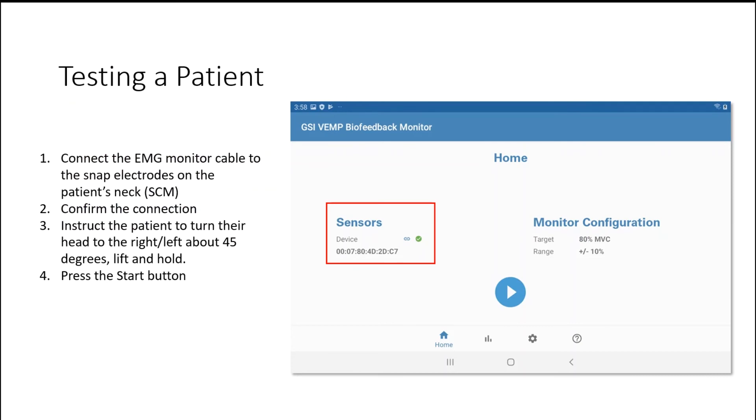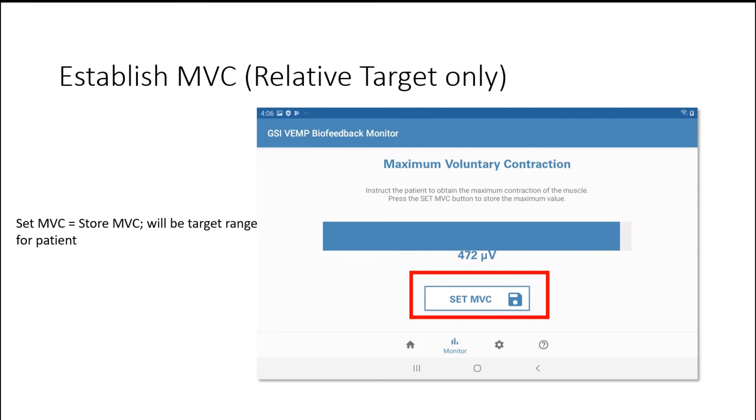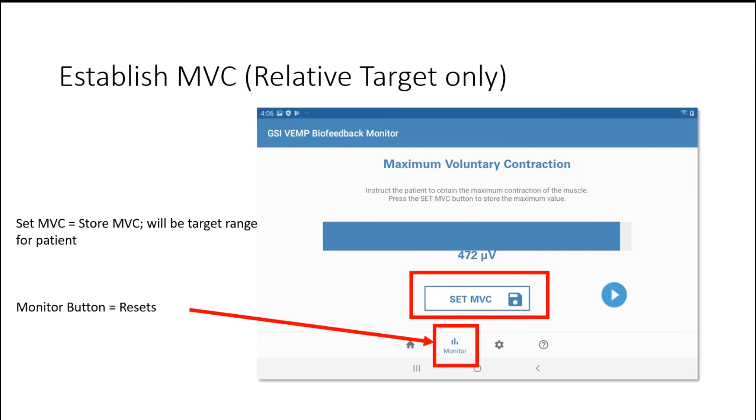Once paired, you'll know because you'll see a green check mark under the sensors window on the home screen. Connect the EMG monitor cable to the snap electrodes on the patient's neck, confirm the connection, instruct the patient to turn their head and lift and hold off the table, then press the start button. If you're using patient-specific targets, you'll get to the maximum voluntary contraction screen. On the test screen, the blue bar bounces around corresponding to the patient's EMG. Once it's relatively stable, tap the set MVC icon and the play button will appear. If the patient is having trouble or you need to re-instruct, press the monitor button to reset the MVC.